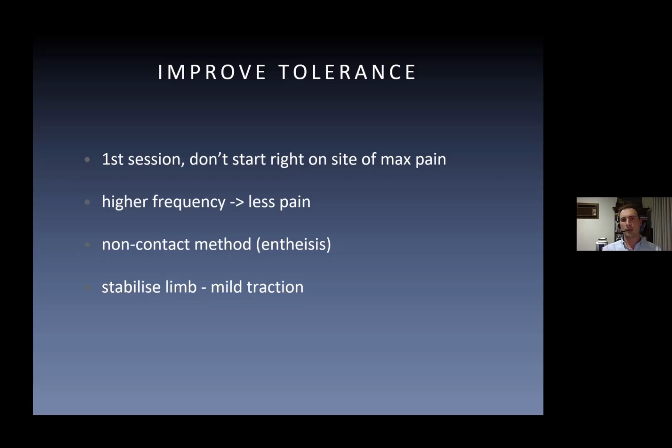Sometimes patients will complain of discomfort, not so much in the area that you're treating, but they're feeling a reverberation in the ankle or further through because the shockwave is dissipating into those tissues.